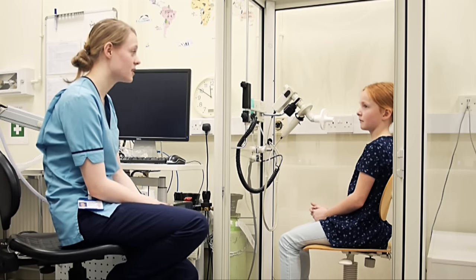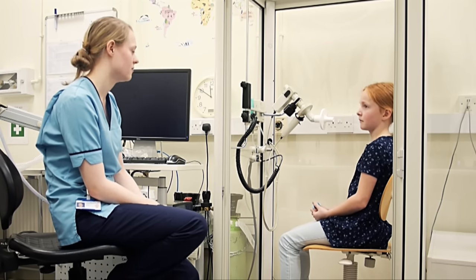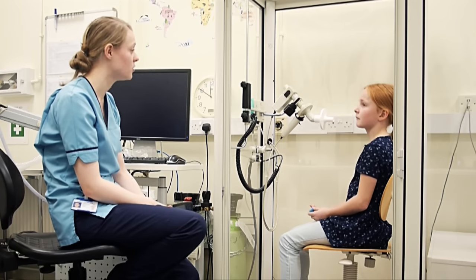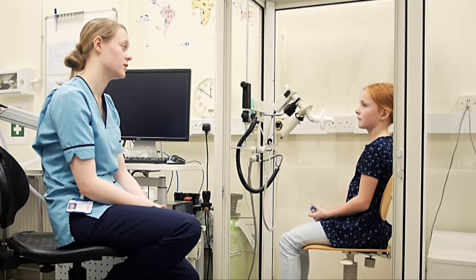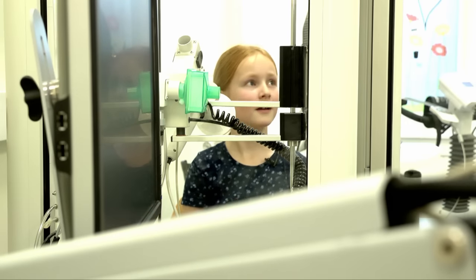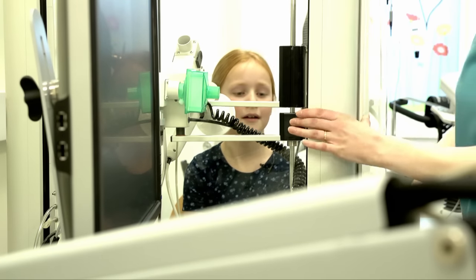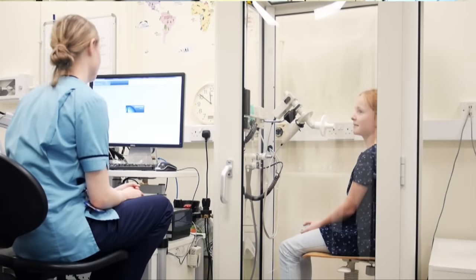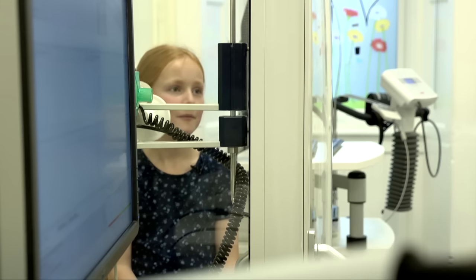So sometimes it gets quite warm in the box, but we'll try not to have you in for too long. And there's a microphone up there so you can hear me talking to you, but you might need to shout quite loudly to talk back to me. Okay, so you don't need to wear the nose pegs just now. We'll just shut the door first of all. You okay? Yes. Right, Susan, that's us ready to start.